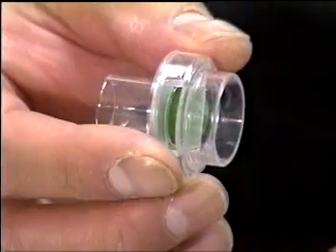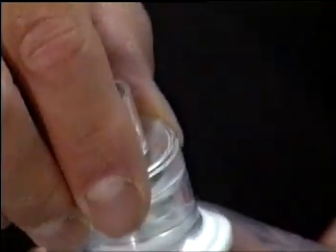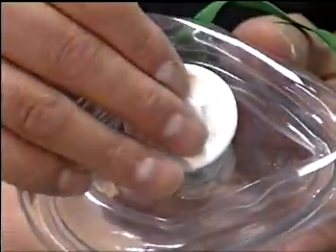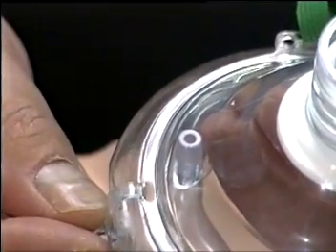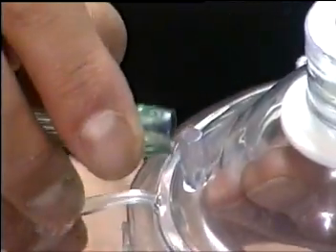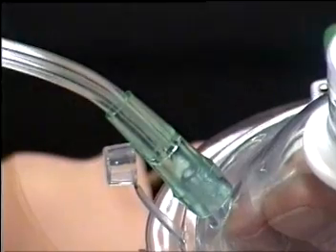The device has a one-way patient valve, bacterial viral filter, and protected oxygen inlet for the attachment of standard oxygen tubing if supplemental oxygen is being provided.